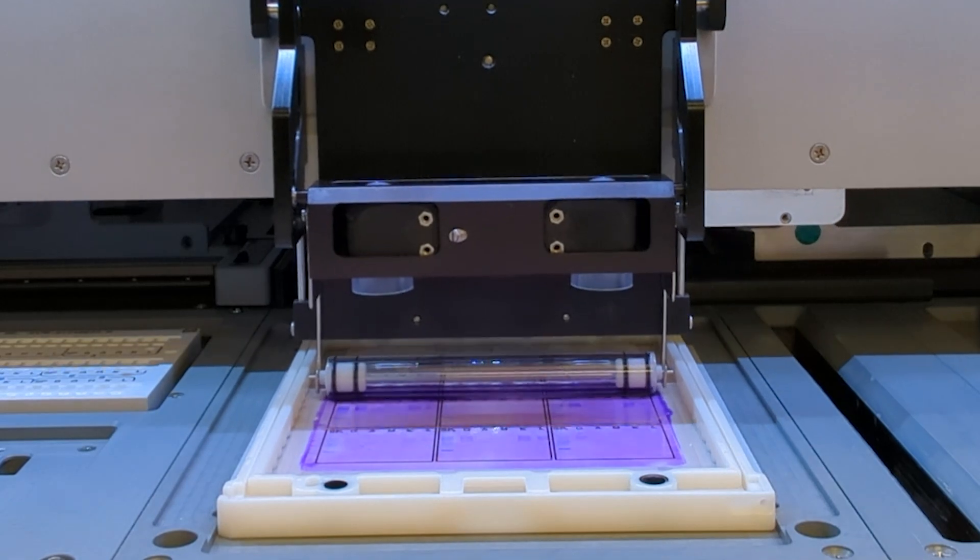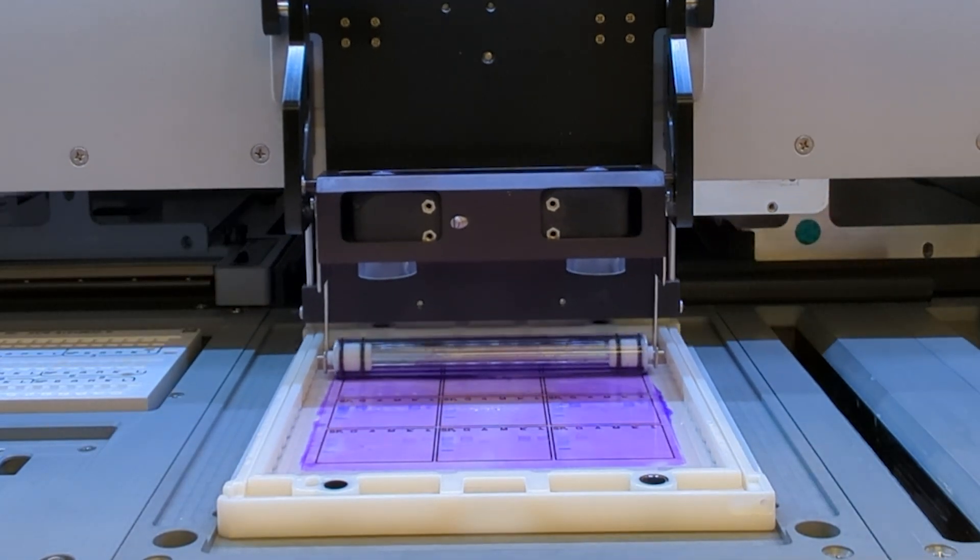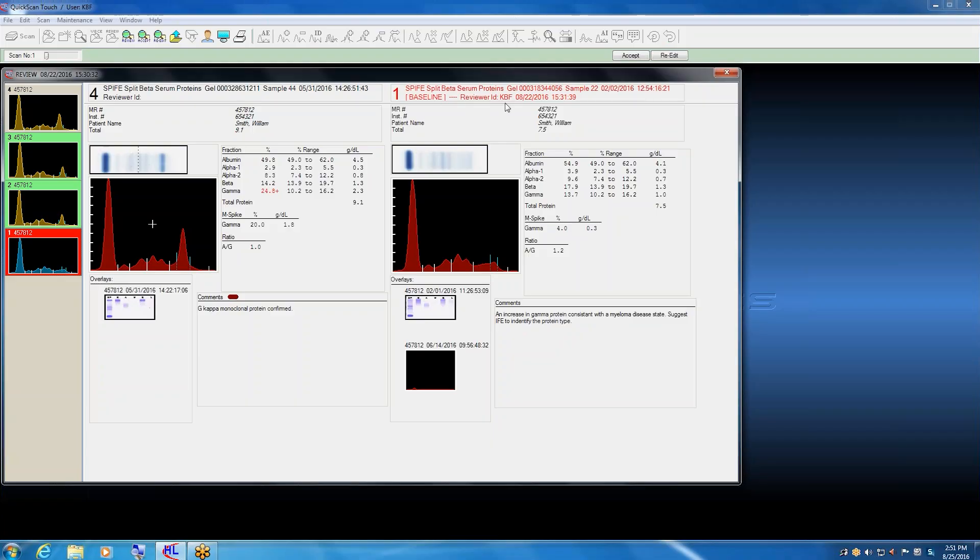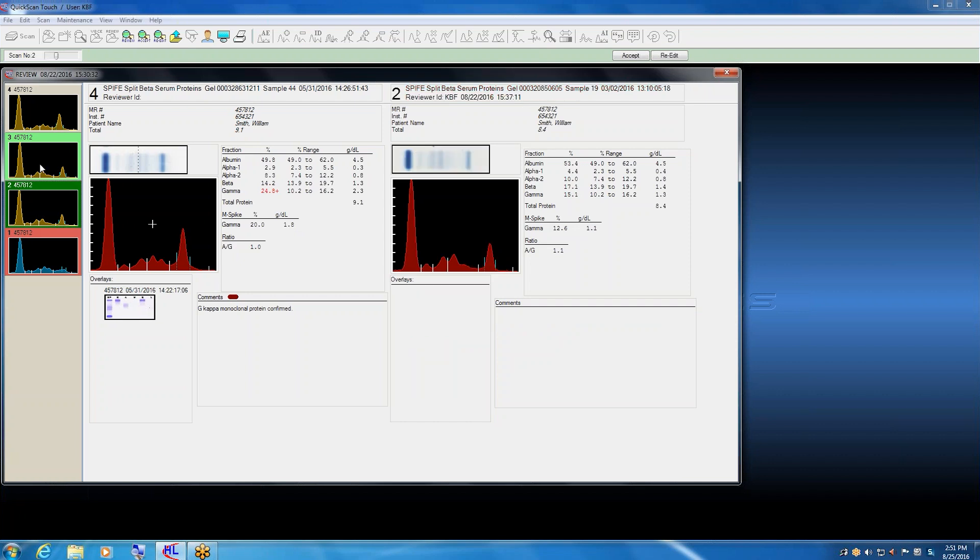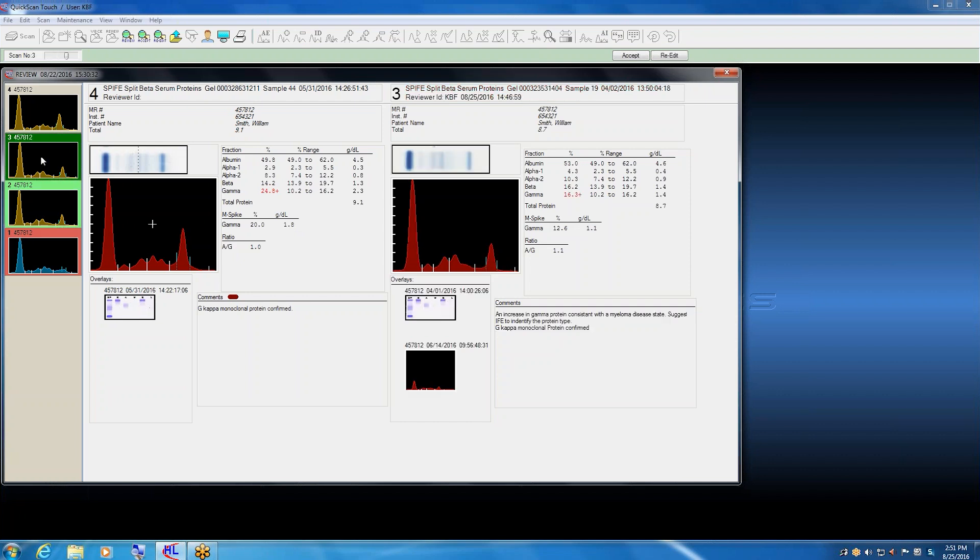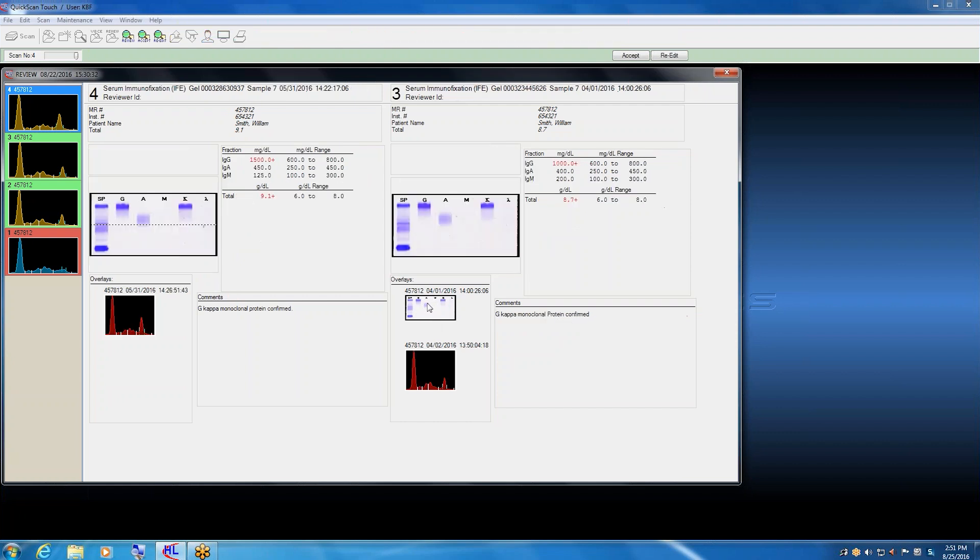The Spiffy Nexus incorporates the enhanced densitometric features of QuickScan Touch Plus software for quantitating, compiling, interpreting, and reporting results with full LIS and networking support. Historic data from all Helena gel and CE systems can be included in reports.